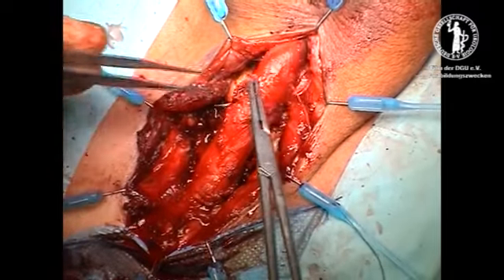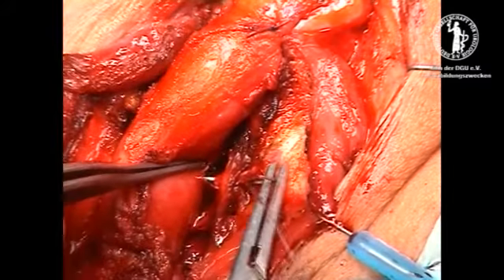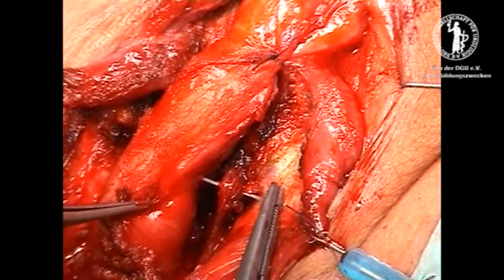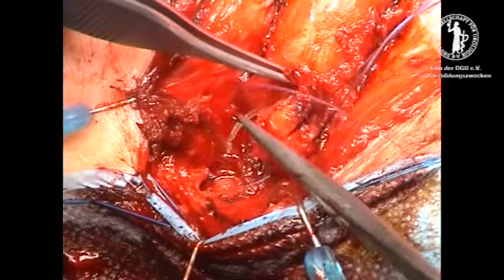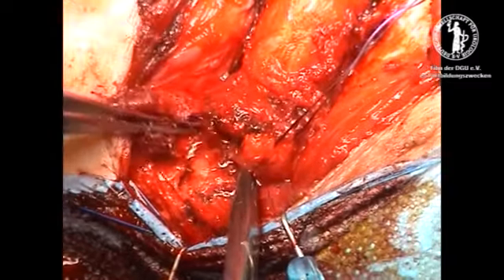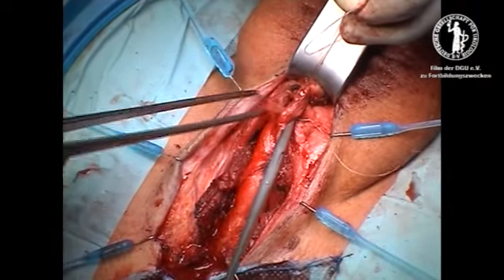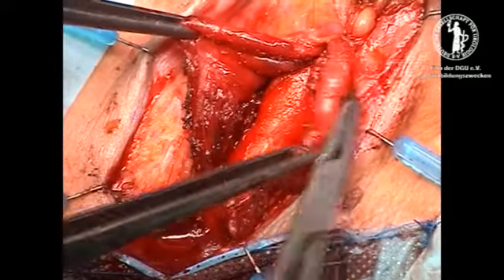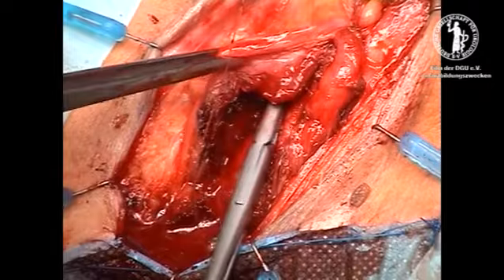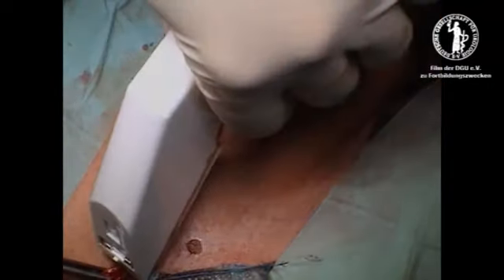To avoid tension on the repair, we fix the urethra at the corpus cavernosum by 4-0 Vicryl. Closure of the bulbar muscle and subcutaneous tissue by running sutures 4-0 Monocryl. An indwelling catheter 18 French is placed for 3 weeks.